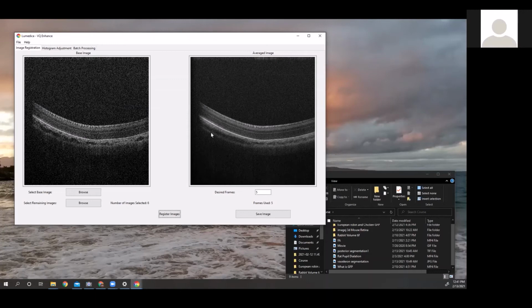Secondly, you can look at the top edge, you see the vascularity of this rabbit retina. Those little dots, like little circles on the top, are just a whole bunch of vessels. And you can see from right to left, there is some more accentuation in those. In some areas, they get a little bit more blurred out. It kind of depends on just the activity within that particular vessel.